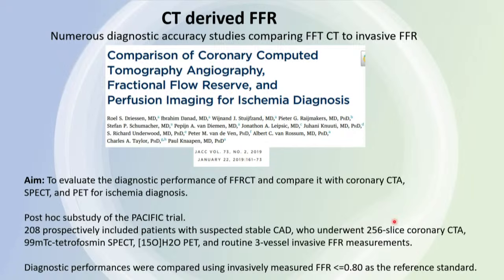There have been many studies that have validated CT FFR versus the gold standard, which is FFR done invasively in the cath lab. This is an interesting study that looked at the diagnostic performance of FFR CT when compared to our other stress testing modalities, namely SPECT, PET, and just coronary CT alone without information of FFR CT. This is a very unique study. It was a sub-study of the PACIFIC trial, and they have 208 patients, but all these patients had a coronary CT, a SPECT, a PET, and an invasive cath for the FFR done in the same patient. So probably not a study that anybody can do again.